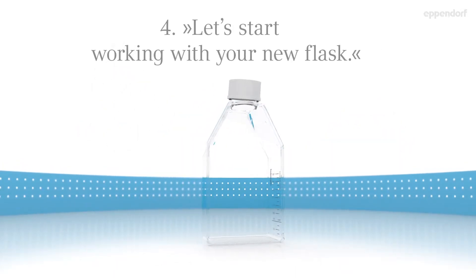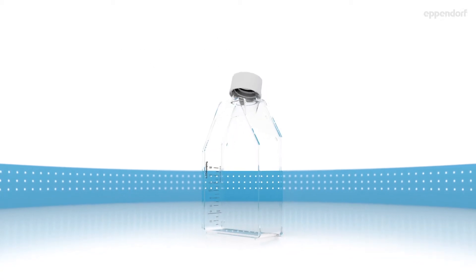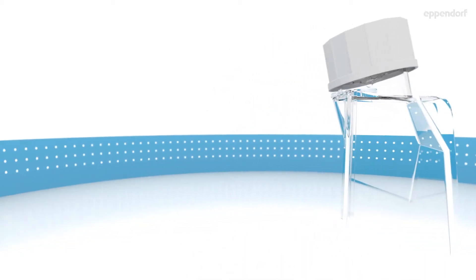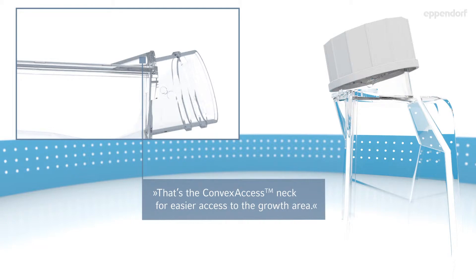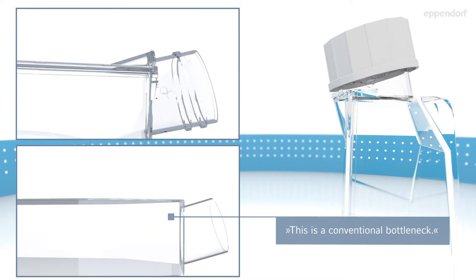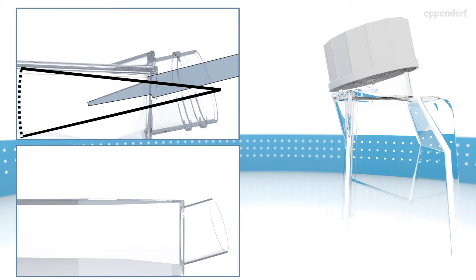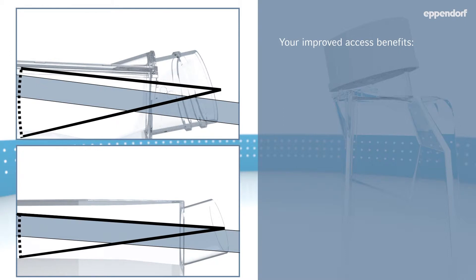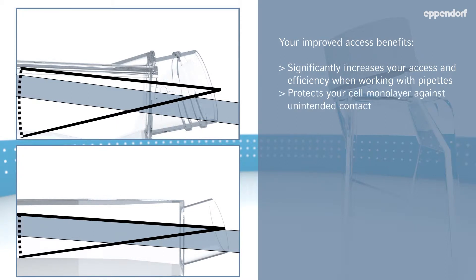Let's start working with your new flask — experience its new intelligent geometry. That's the convex access neck for easier access to the growth area. This is a conventional bottleneck for comparison. Your improved access significantly increases your access and efficiency when working with pipettes, protects your cell monolayer against unintended contact, and allows simplified and ergonomic handling.